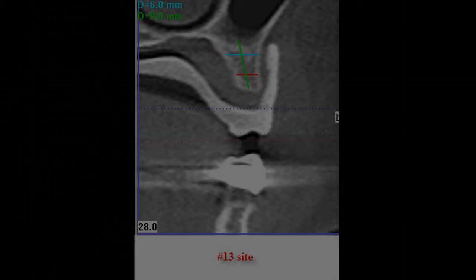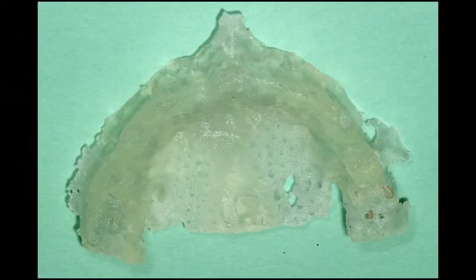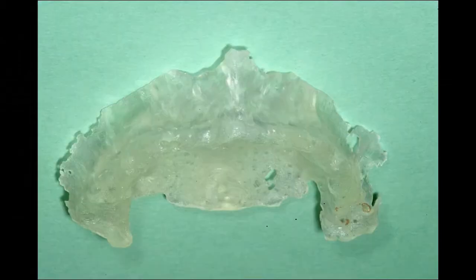Okay, so we put this up in the oven for about 15 minutes just to heat all this up. Then you lower it, and you solder it immediately. Make sure you don't get a cold solder joint because all this is preheated. So here we are, soldered together, all polished up. Then we're going to go readapt this to that inside of her denture.